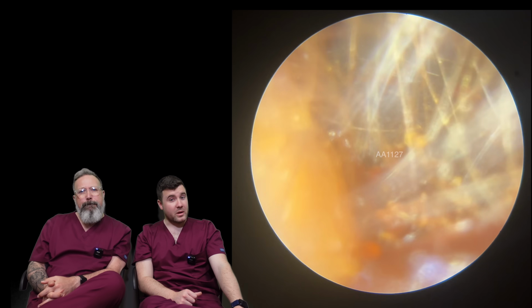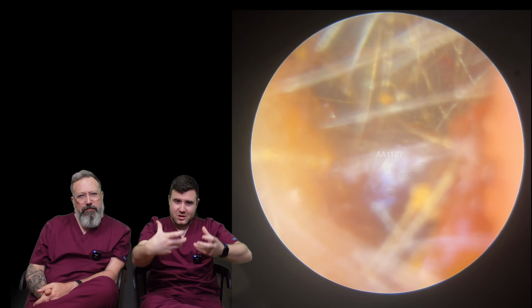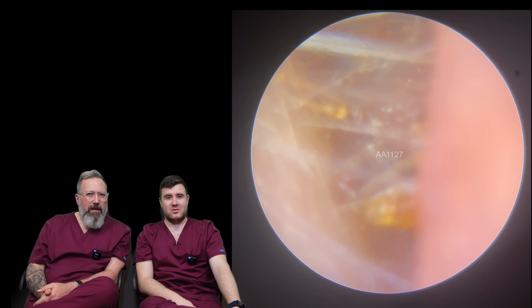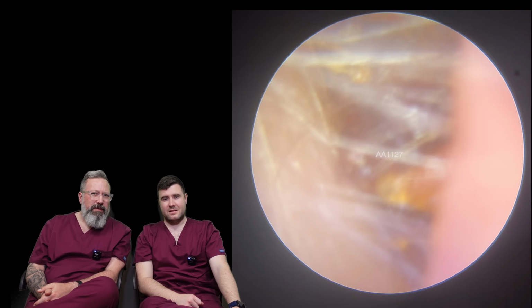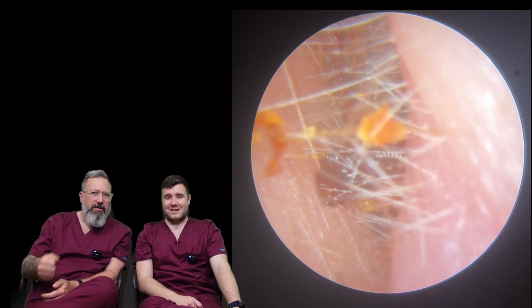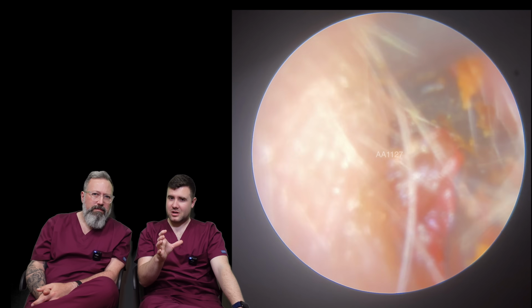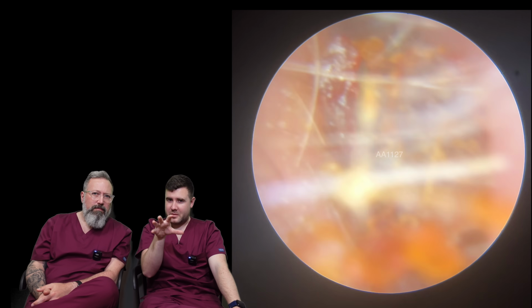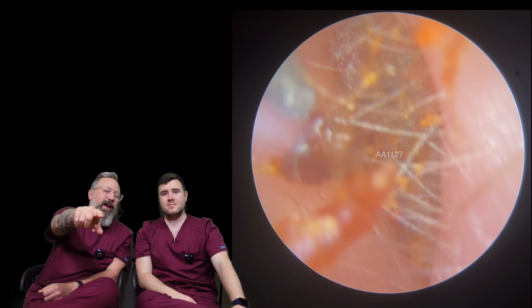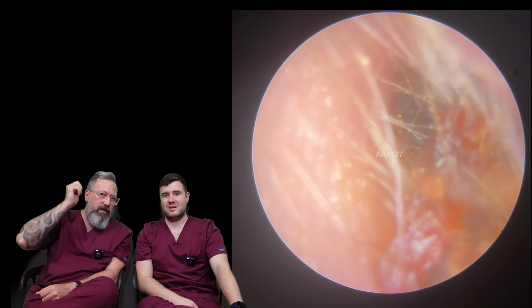What I was hoping was that it would do that kind of sliding thing where you slide it from the bottom and it was just going to... No, it's not going to do that. We might take a little bit away, I think. Something's pulling though. You can see the pressure on the pull on that just to pull that out. You say to the patient, you're going to feel a little bit of a pulling sensation now. We need to put a little bit of pressure on this to get it moving. Oh no, it's wedged. You've lost your gap now, haven't you? It's gone. Oh, I'd like to make things a little bit easier for myself.